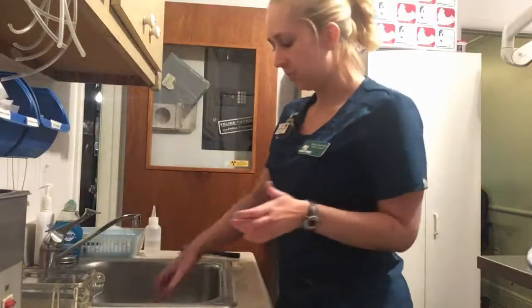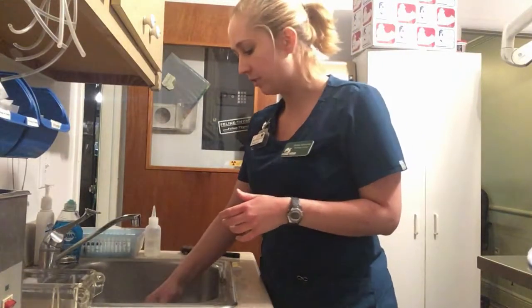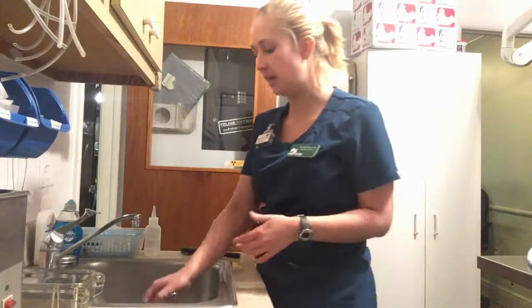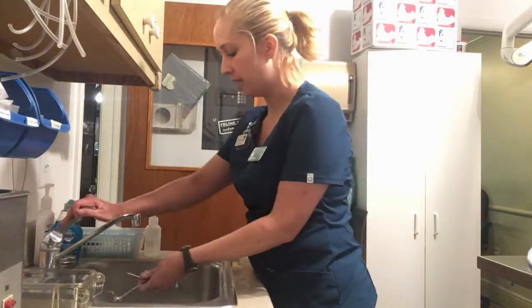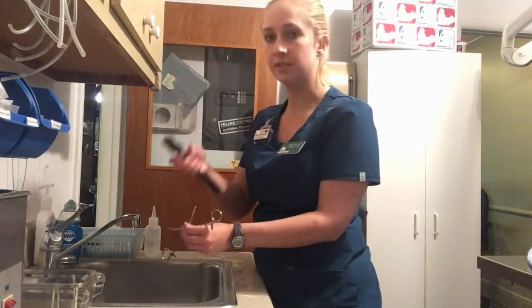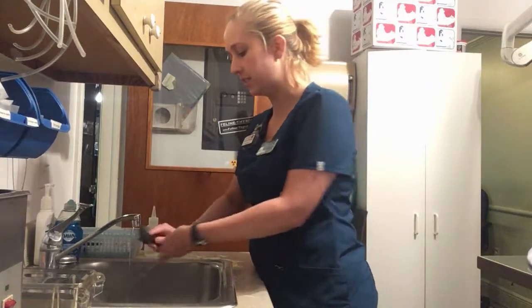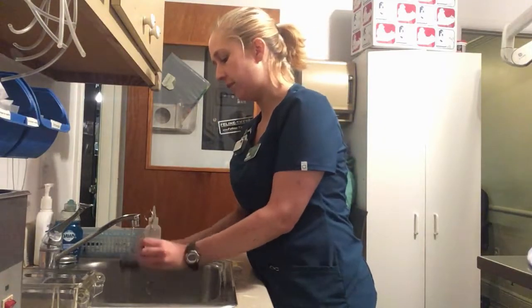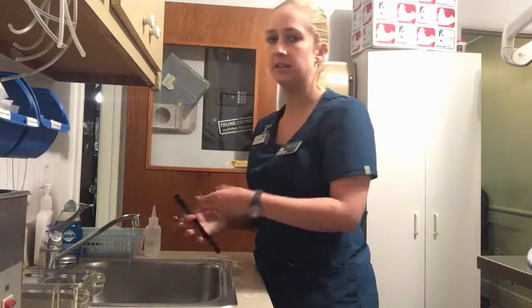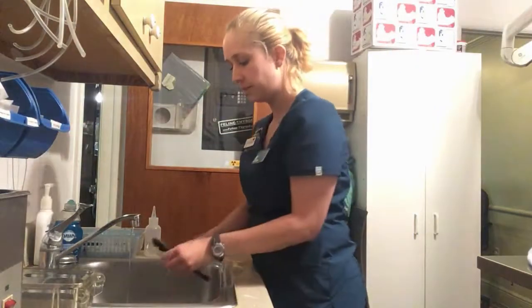I've had my instruments soaking in some water for a little bit, just sitting in our sink, trying to loosen up any of the blood and tissue. Once you do that, you take your scrub brush and use the soft side, and you go through each part of the instruments, getting off any pieces of blood and tissue that are left behind. Then I'm going to transfer it to our ultrasonic shaker.